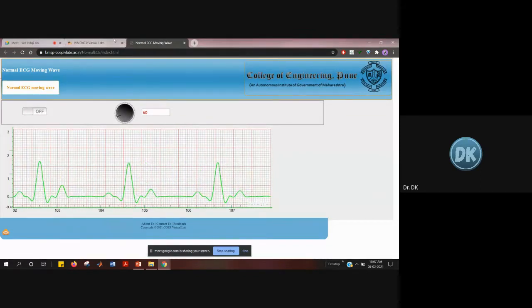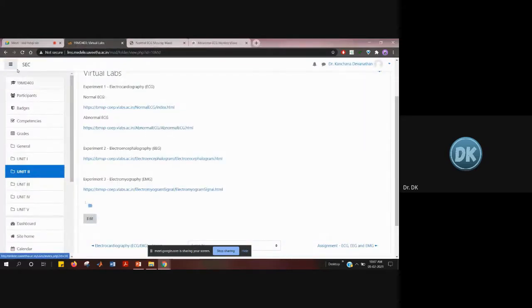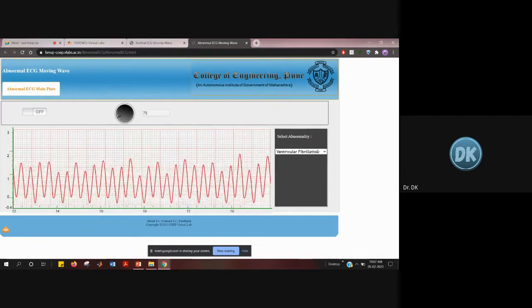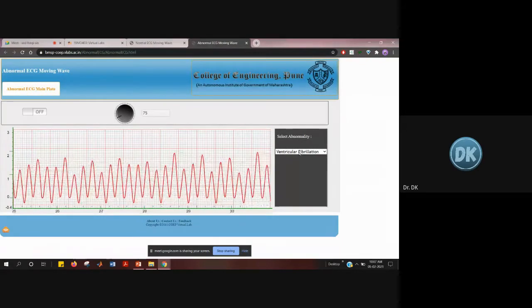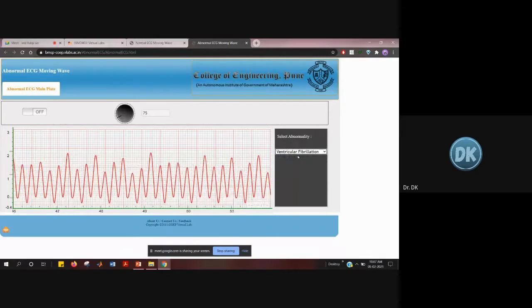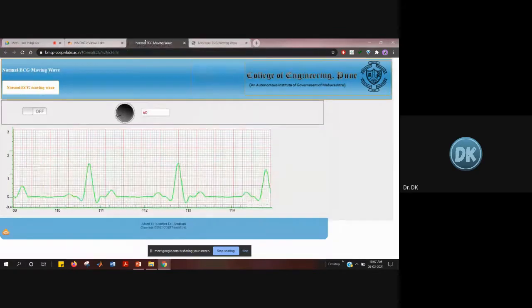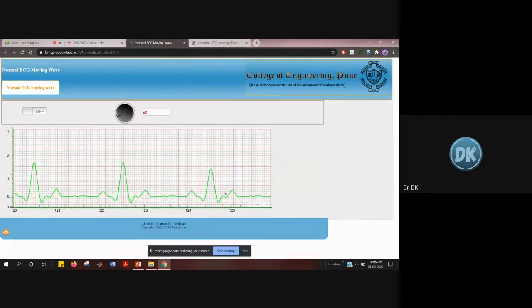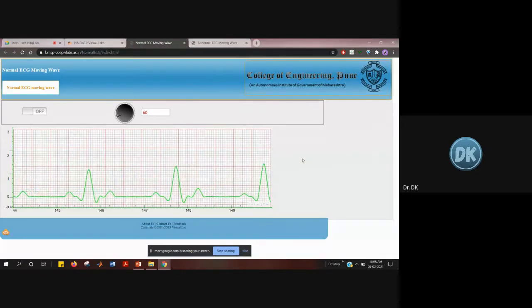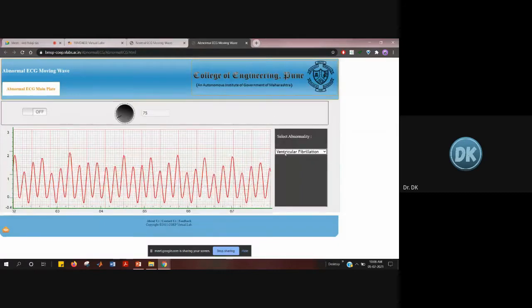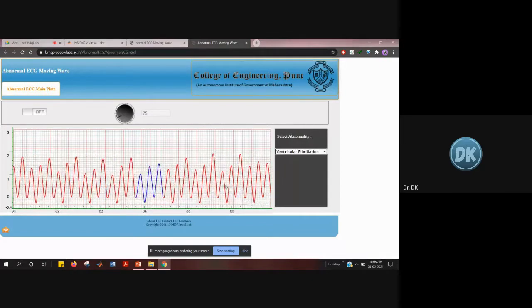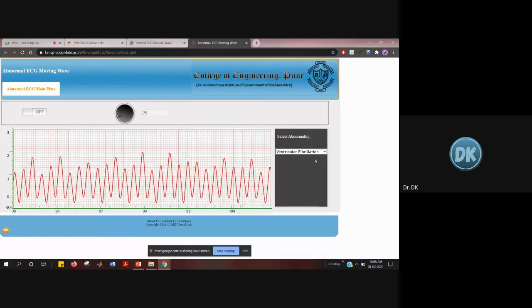This is the normal ECG waveform. Now for the second experiment, this is the abnormal ECG. If you open that link, you have different conditions on the right side under 'Select Abnormality.' The first one is ventricular fibrillation — a condition where the heart's ventricles can't pump blood normally. If the electrical impulse is not traveling inside the heart properly, you get different abnormalities. This waveform shows an abnormal heartbeat.